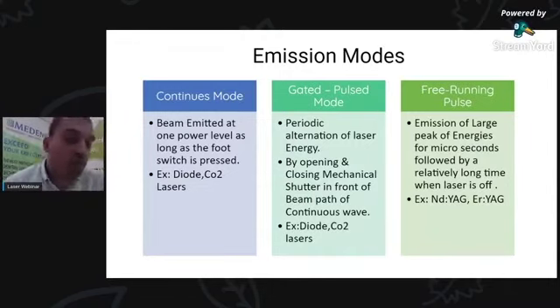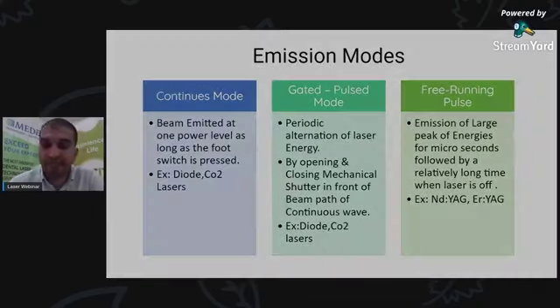As the laser works, the laser delivers heat. Once the laser stops, the heat will reduce. This makes us avoid carbonization and gives us better treatment options for some cases, as we can discuss in the later slides.